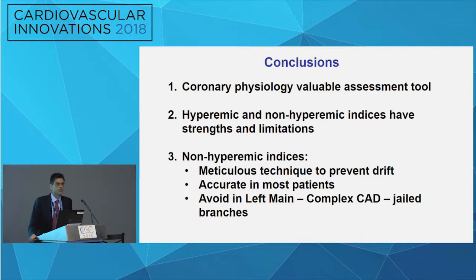Perfect. Does it apply to renal failure patients, who have borderline hemoglobin, not from bleeding? Have you seen any cases, or had any experience with these people, where you had discordance in this? There has been, I think. Yes. The lower they get, as they get to 9, you start wondering if it's true. Yes, again, I think it's an excellent point.